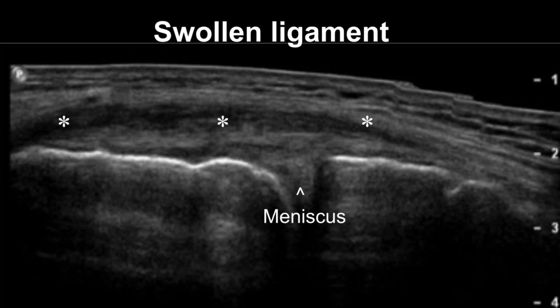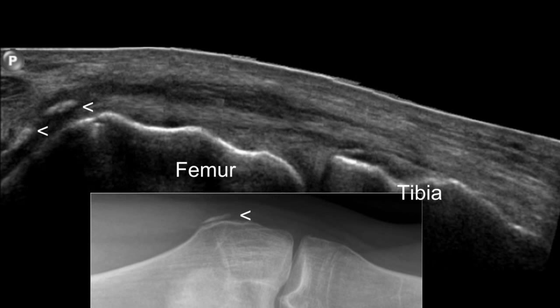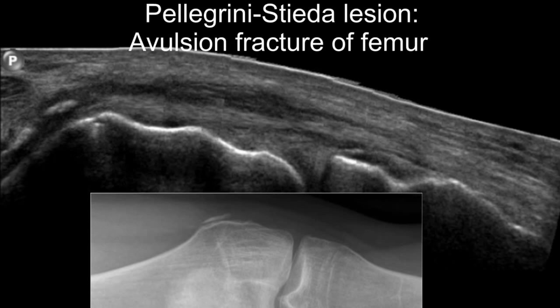The most common signs of an injured MCL are thickening and swelling of the ligament with heterogeneously hypoechoic change. In cases of severe injury, echogenic foci superficial to the bony cortex of the femur may be noted in the proximal part of the MCL. This particular type of injury is known as a Pellegrini-Stieda lesion.